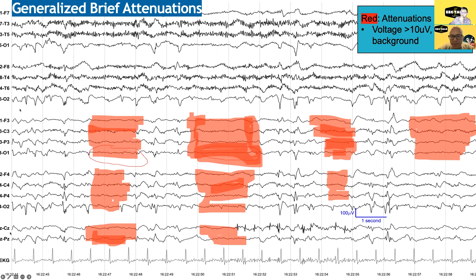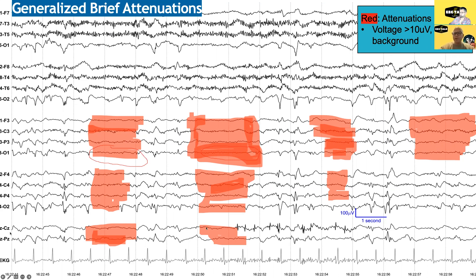It looks like there are GPDs going on, and every once in a while the EEG voltage drops — the GPDs go away and it gets a little bit flat. This is a case of brief attenuation. It's not 50% suppressed, so officially we would not call it burst attenuation or burst suppression, but these are intermittent brief attenuations.